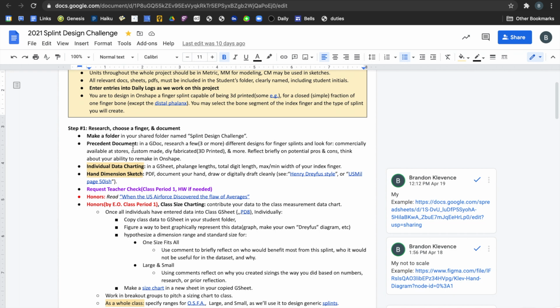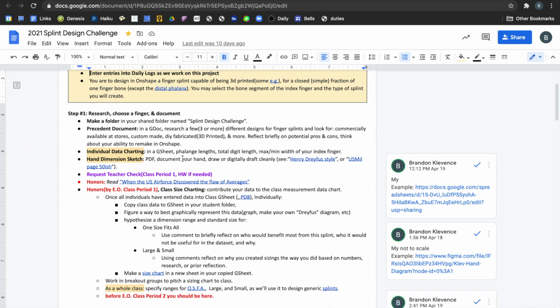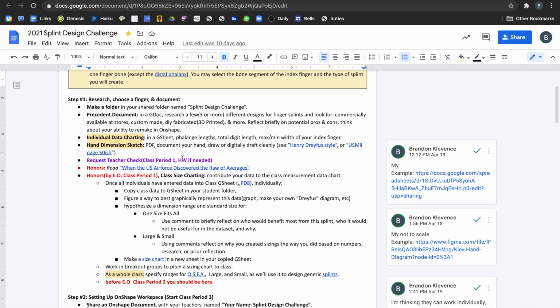We're working on designing a functional splint, though I wouldn't advise using it, in Onshape that we can 3D print. So you can research a bunch of different types of splints, either ones that are mass produced or ones that are custom made and 3D printed or fabricated in some way or another.